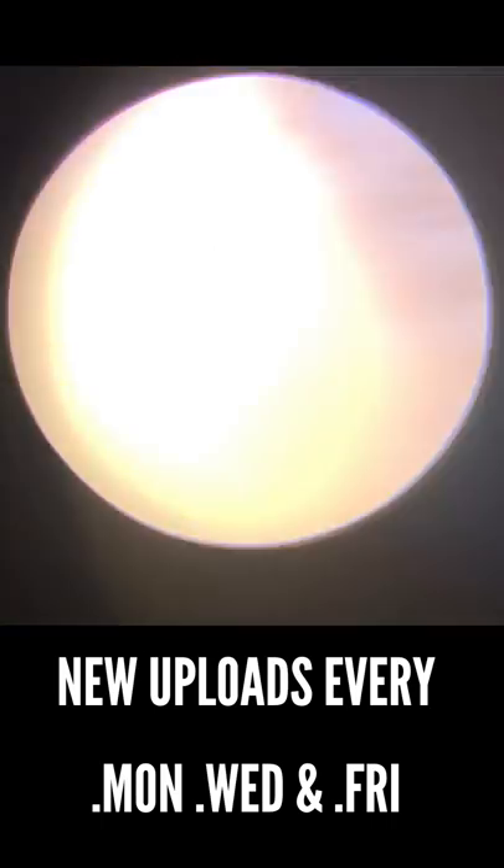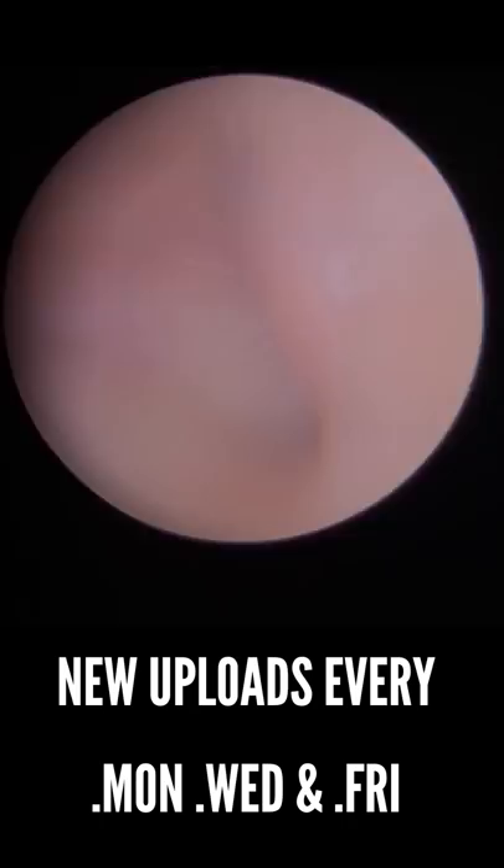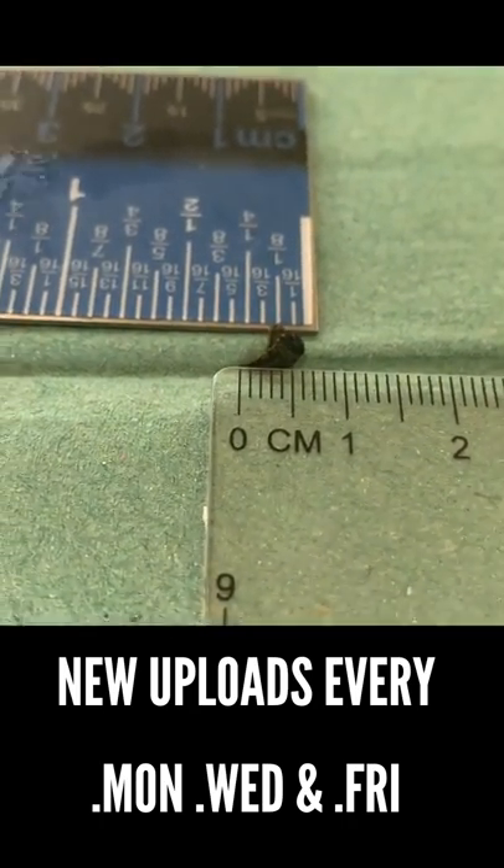So it was quite uncomfortable for this patient. You can see the eardrum looking lovely and healthy. All that wax came away in one piece. So a very small little bit, but yeah, causing a few issues.